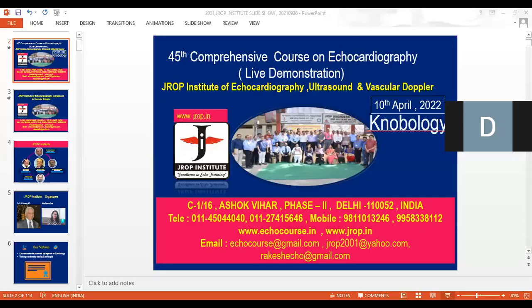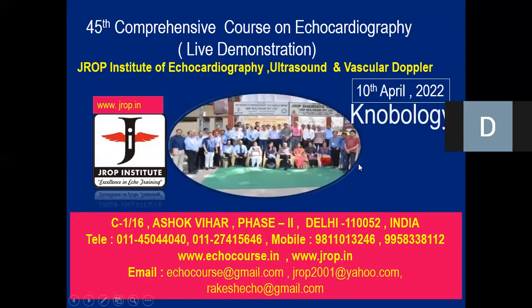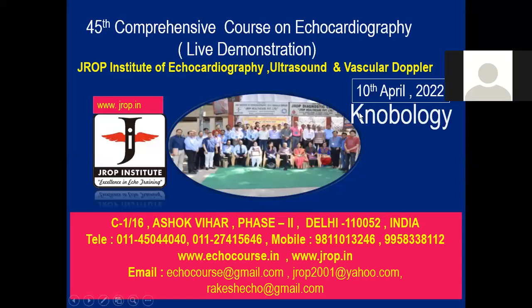Okay, friends, I think everybody is set right now. What we are going to talk about today, on this 10th of April 2022, is Knobology in the 45th Comprehensive Course on Echocardiography.